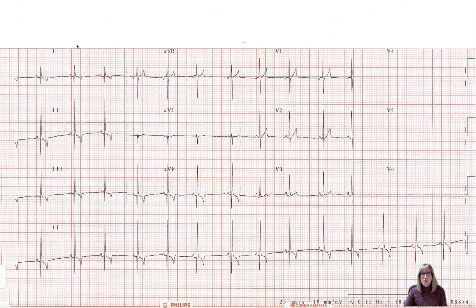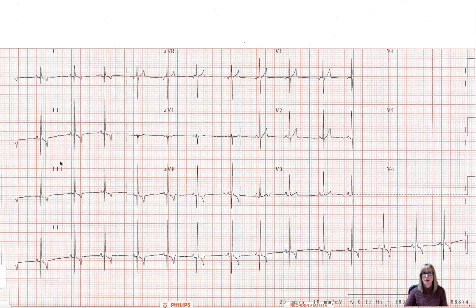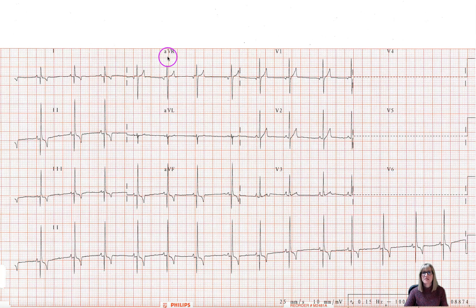The format is that the machine will simultaneously record the six frontal plane leads in the top three lines, followed by the six chest leads. So here we see lead one, lead two, and lead three being simultaneously recorded in the first, second, and third lines respectively. And then when we see these little vertical tick marks, the machine is switching to the next three leads — in this case the augmented leads: AVR, AVL, and AVF.